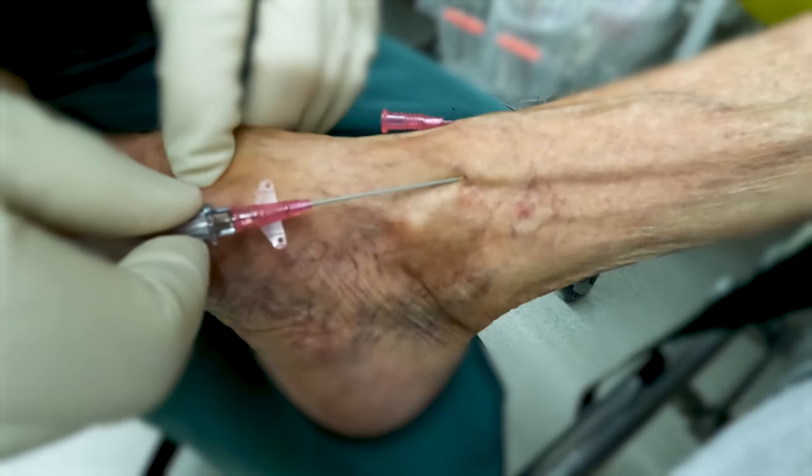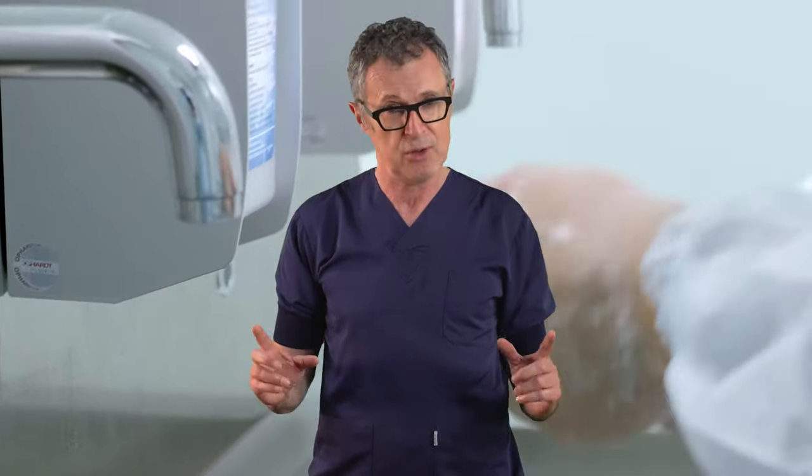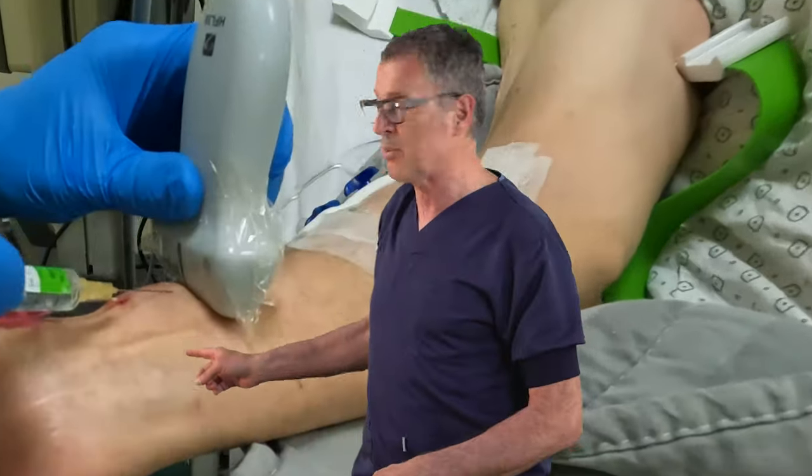And there you have it — our deep dive into the complexities and techniques of successfully inserting an IV into the foot. Practice and persistence are keys to mastering these techniques, and always prioritize patient safety and comfort throughout the process. Using a little bit of local anesthetic subcutaneously for the skin can really make this process, particularly for the lower extremity, a lot more pleasant for patients.